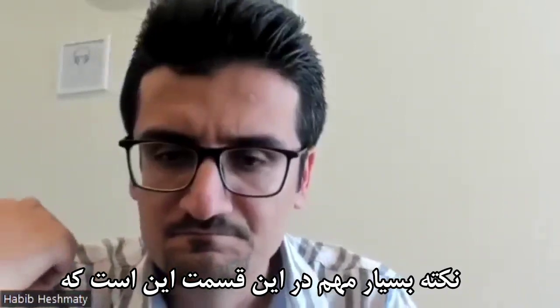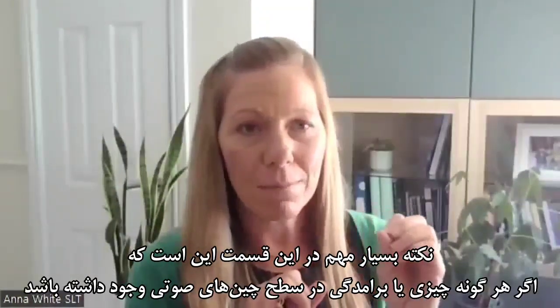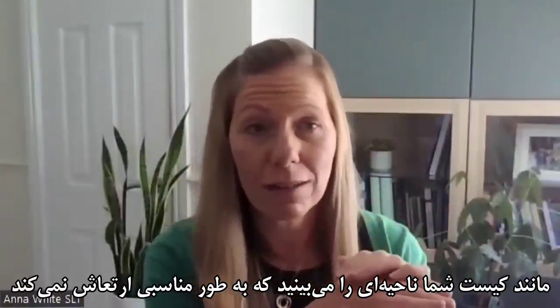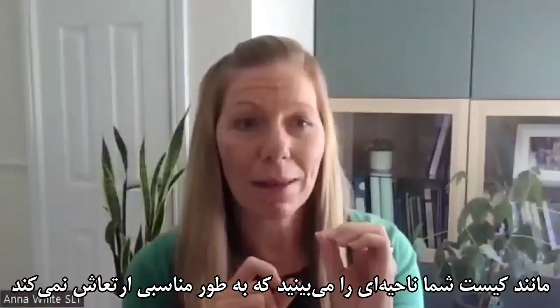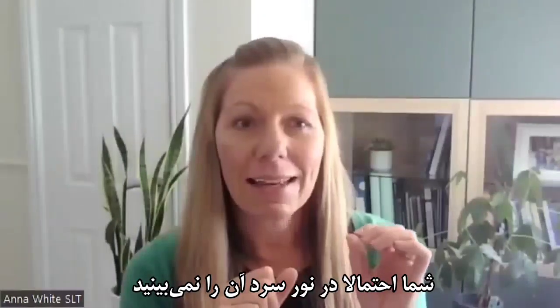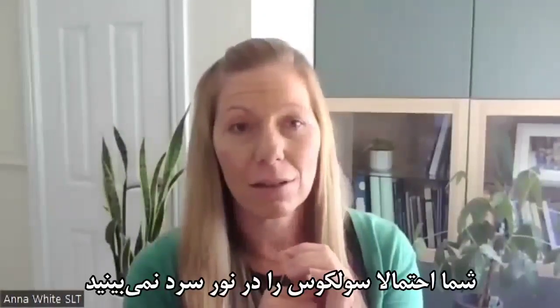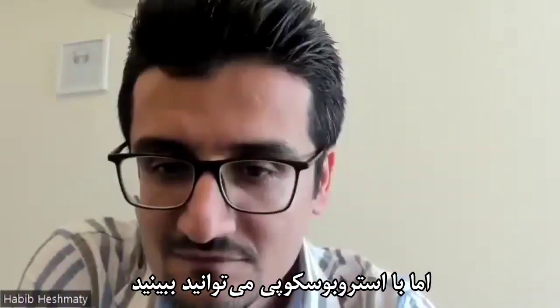And the really important part of that is that if there is any lump or bump under the surface of the vocal fold, like a cyst, for example, you will see an area that isn't vibrating properly. You might not see that on cold light. And it's the same for a sulcus. You may not see a sulcus using cold light, but you will with stroboscopy.